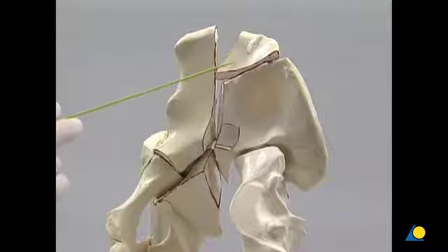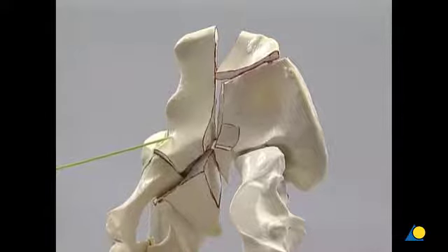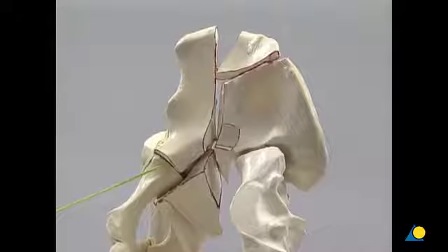This is the large free fragment, and this is the anterior column component with the acetabular dome. It is also possible to view the posterior column component. Part of the anterior column with the superior pubic ramus can be seen as well. The femoral head is visible, or at least palpable, through the fracture of the quadrilateral surface.